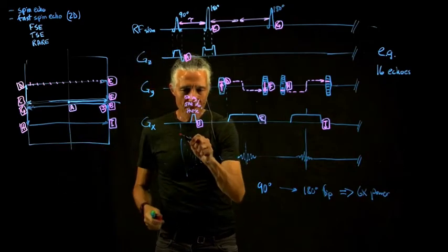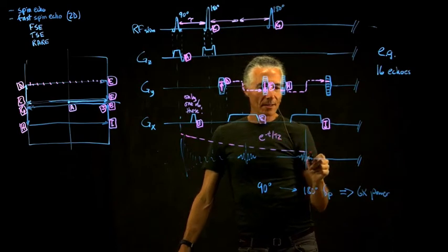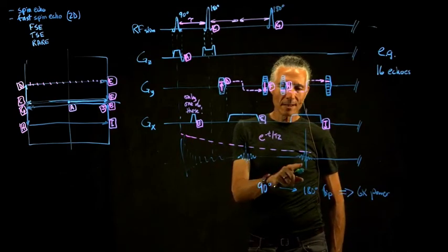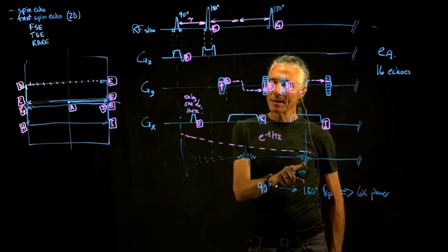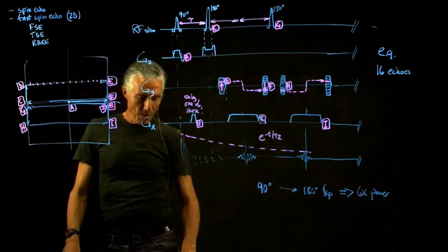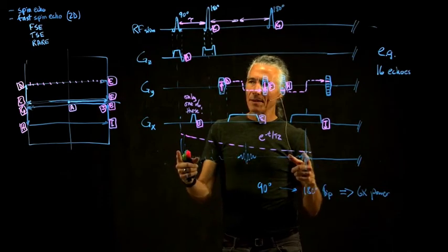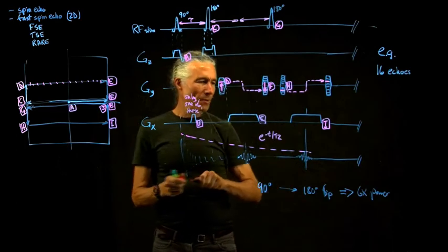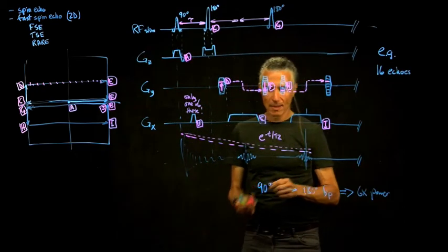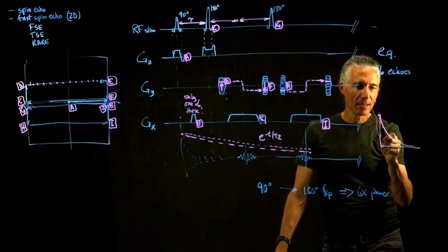So if you look at this curve here, e to the minus t over T2, you can see that this echo is at a longer time than the first echo. That means the amount of T2 decay that occurred is different in different parts of k-space. That's kind of strange, because normally you're thinking what we want to do is select a particular echo time and then look at differences. So what is contrast? Contrast is going to be differences in this T2 decay curve. It's kind of hard to see at that scale, but we're trying to figure out the difference between this tissue and this tissue.